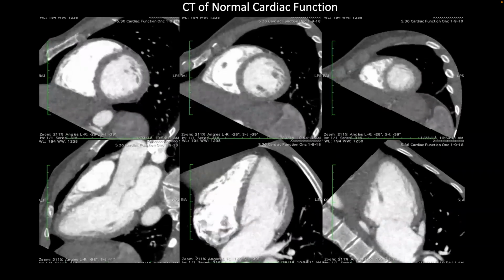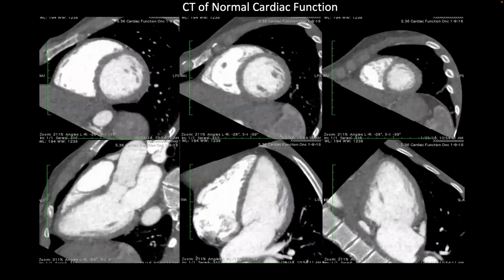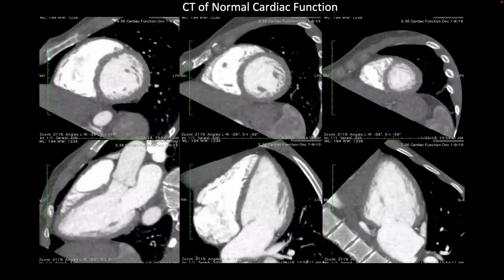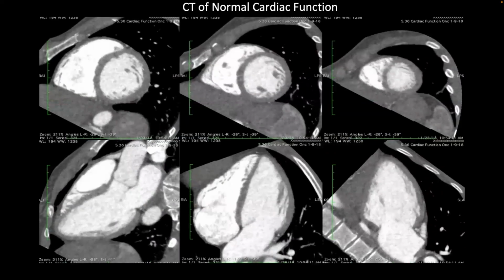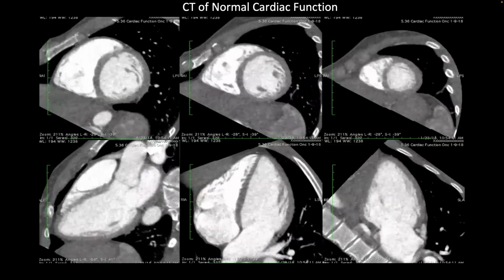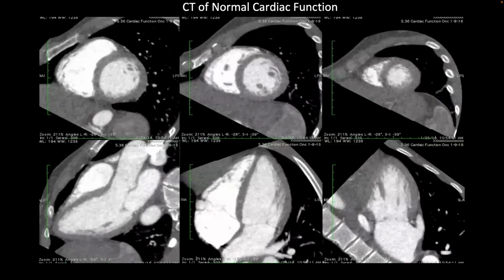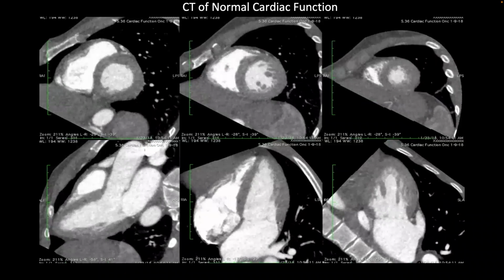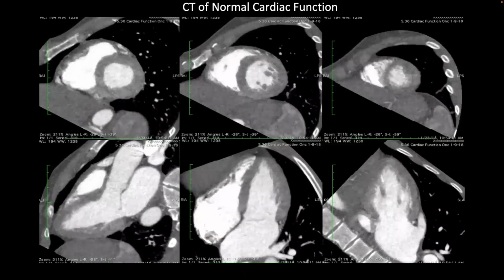Here's what CT looks like in a movie. I think this is like a 1.5 millisievert movie, right, of this person, because we're down at, I think, 120 mA or something. So for cardiac function, you can get away with really low dose, right? This is actually reasonable. This is about probably an ejection fraction of 50%, something like that. This person is looking okay.